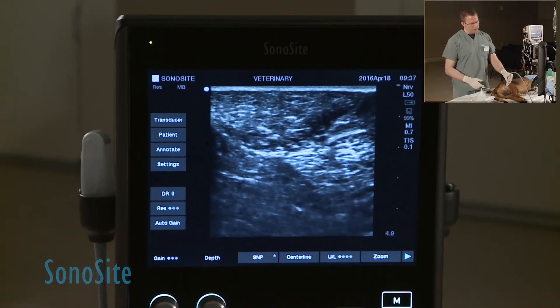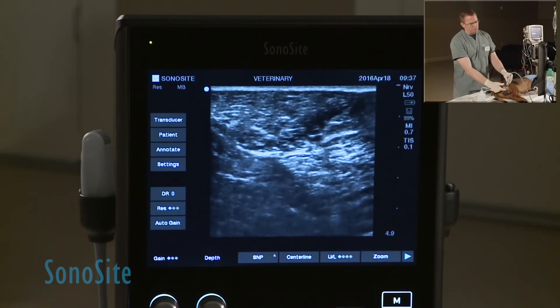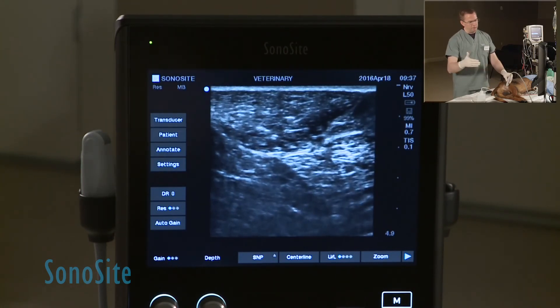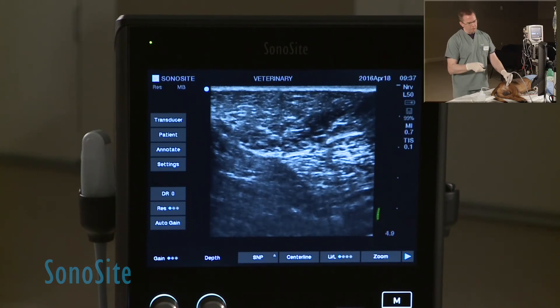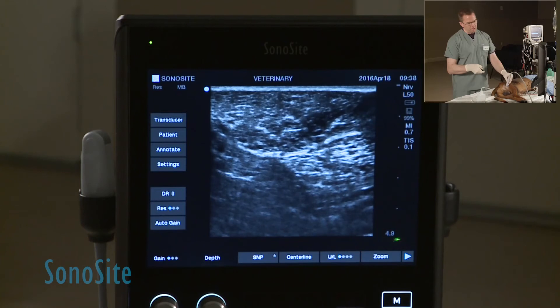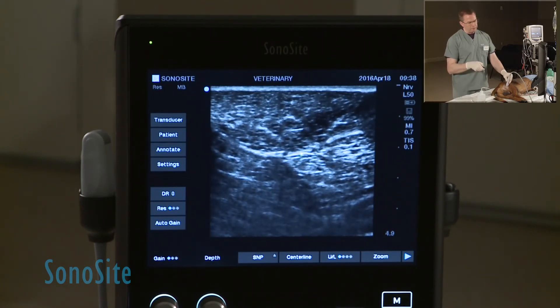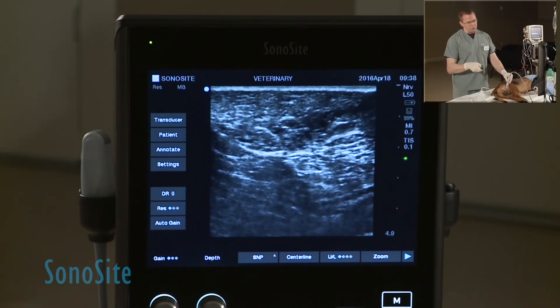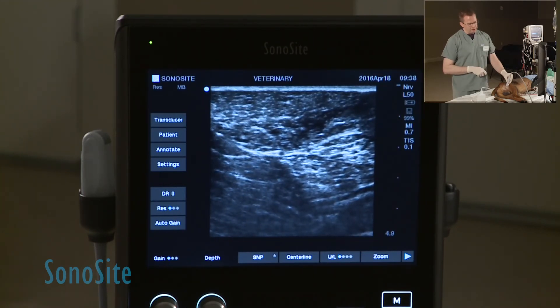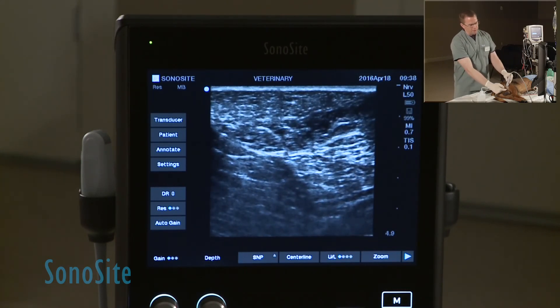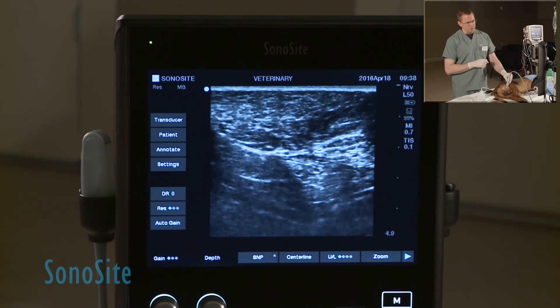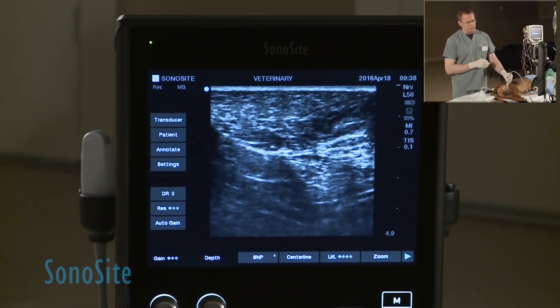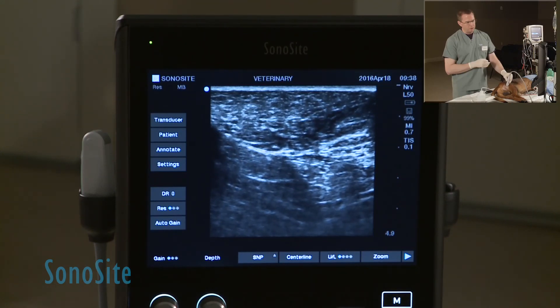As we place our needle from a caudal direction, you can see my finger gently pushing on the surface of the dog. The needle is going to be entering from the right side of the screen. Looking at the depth markers on the right-hand side, the very bottom of the ultrasound monitor is 4.9 centimeters. The sciatic nerve in the middle of our image corresponds to approximately two to two and a half centimeters from the skin surface. We're going to come in caudally, placing the needle in-plane underneath the ultrasound beam, and we'll see that needle as it comes across from the right side of the screen until we get it located right adjacent to that sciatic nerve.